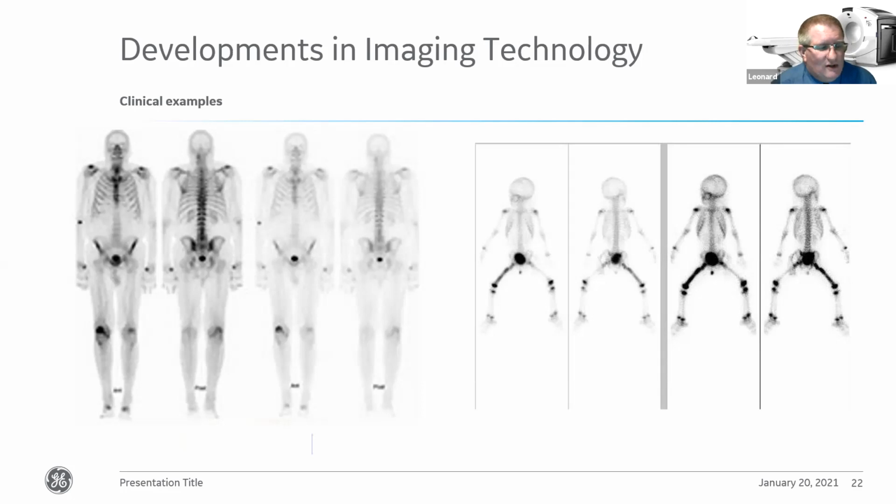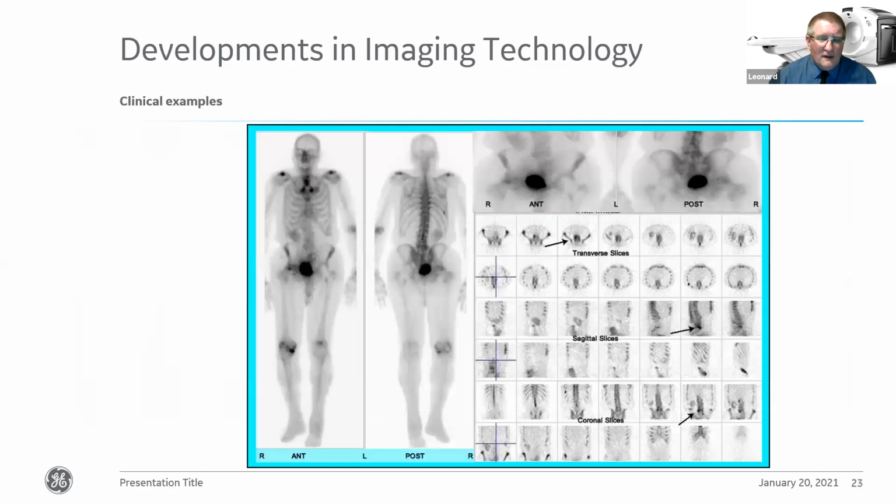But this type of imaging wasn't really possible with a single-headed camera previously because it would take too long to do. But then what we had with other patients as well is the capability that we can now see more detail and localize that within the patient itself.